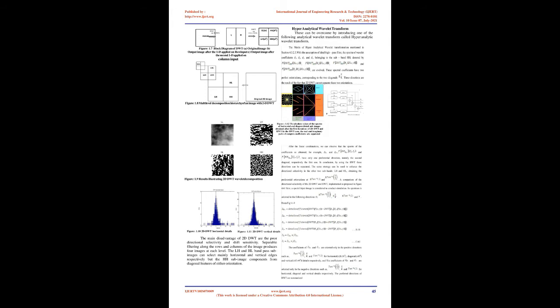supported spatially and measures closeness. This is often the central idea underlying the bilateral filtering interpolation technique. Later we apply a smoothing process to the pixels that are in close geometric proximity having similar contents. Thus, it can be assumed to preserve the average over close pixels.